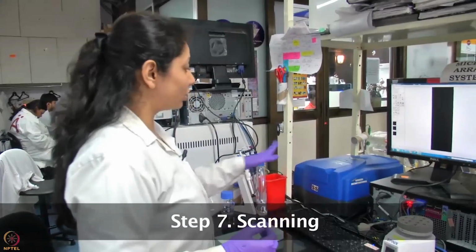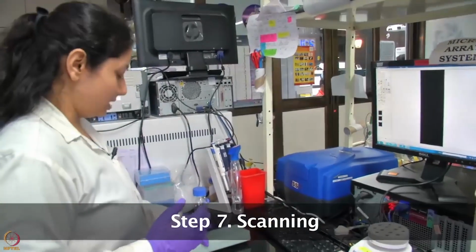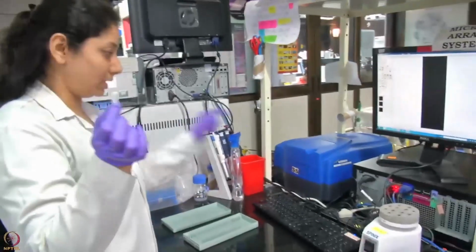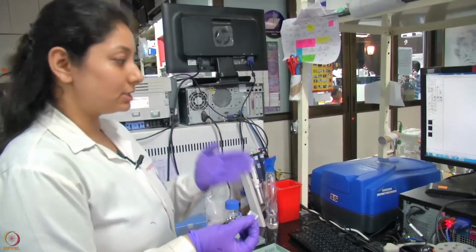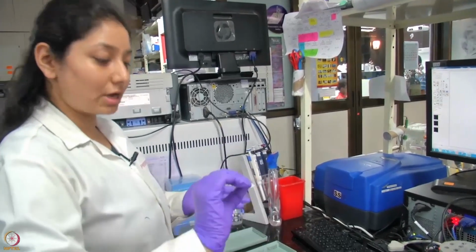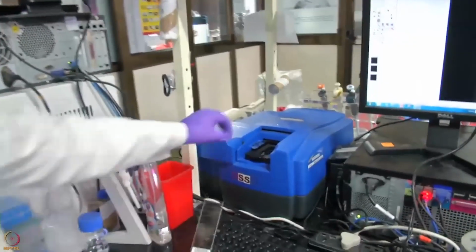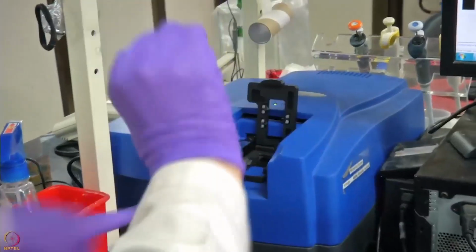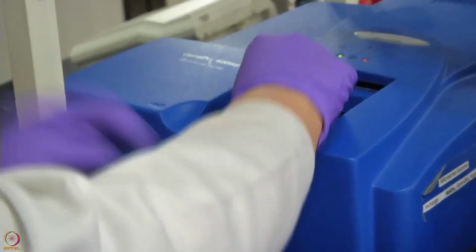So for scanning, make sure that the scanner is on for at least 20 minutes so that the lasers are stabilized. Now, this is one of the processed slides which I am going to place inside the scanner. So in this scanner, we keep the slides in the inverted position, that is, the surface that contains all the proteins should be facing downwards. So this is the area where the slide is kept. This is the slide holding area. Place the slide opposite so that the protein spots are facing the lasers.